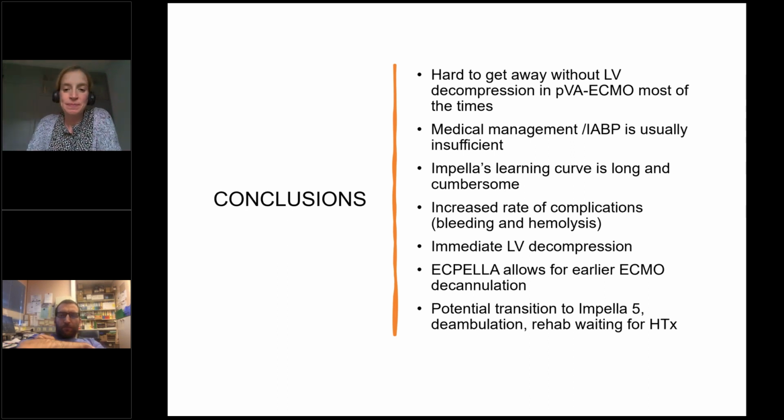Yeah. Now, with respect to the practical management, what would be your regular choice? I understand there are different models for Impella that can handle different volumes per minute. Do you have a standard approach? And what would be your presumably regular flow rate that you would think most patients would do well with? So we use Impella CP when we're using a femoral approach, a percutaneous approach, and we use an Impella 5 when we're using an axillary approach.